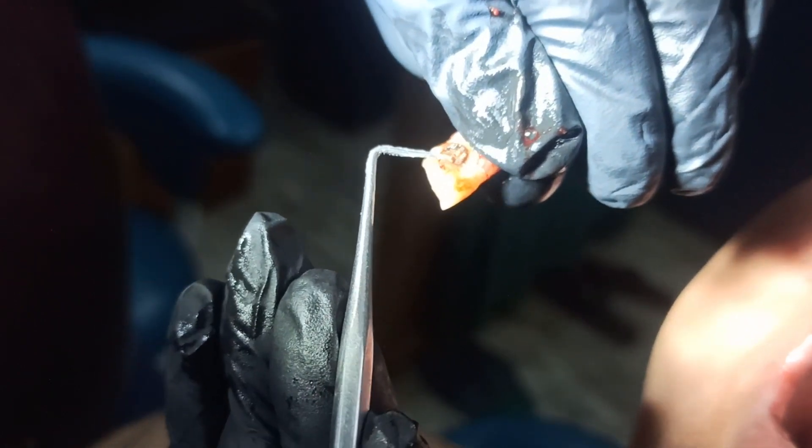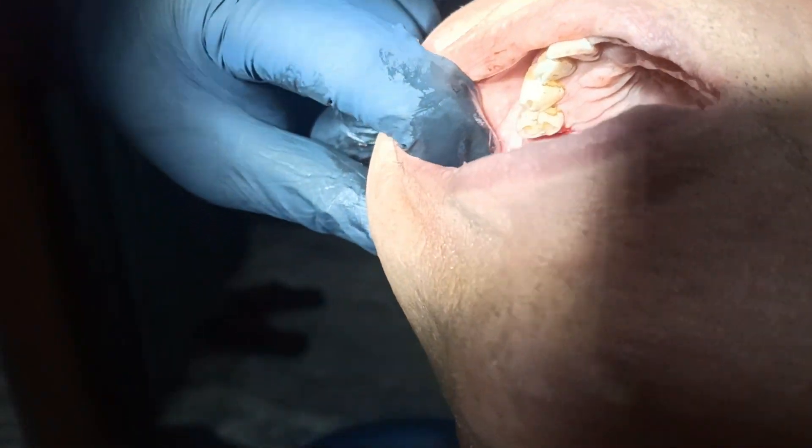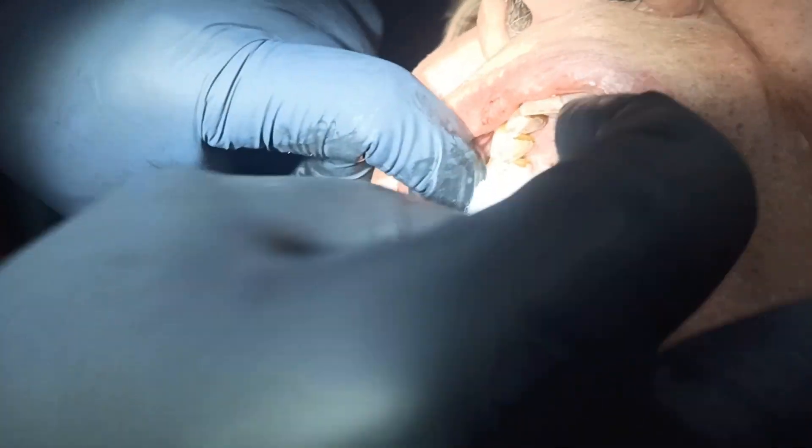I have to put a piece of paper. I have to put cotton on it and close it.